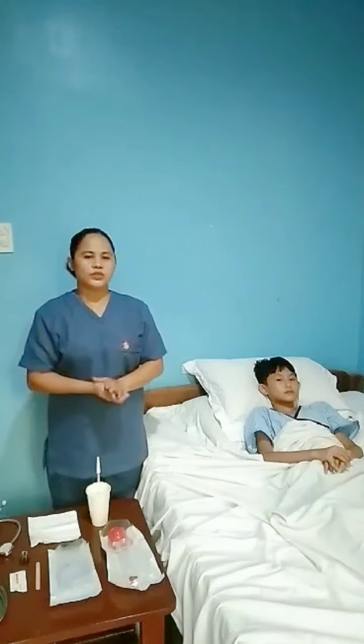So the definition: a nasogastric tube is a pliable tube that is inserted through the client's nasopharynx into the stomach, and it has a hollow lumen that allows the removal of gastric secretions and the introduction of solution in the stomach. There are four main purposes of the insertion of the nasogastric tube.